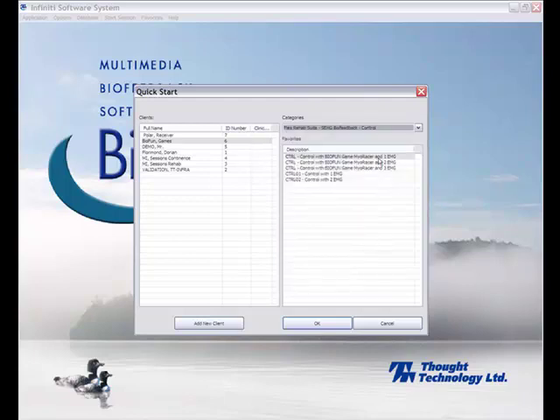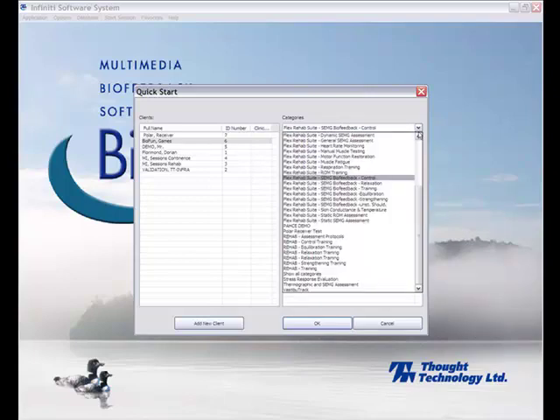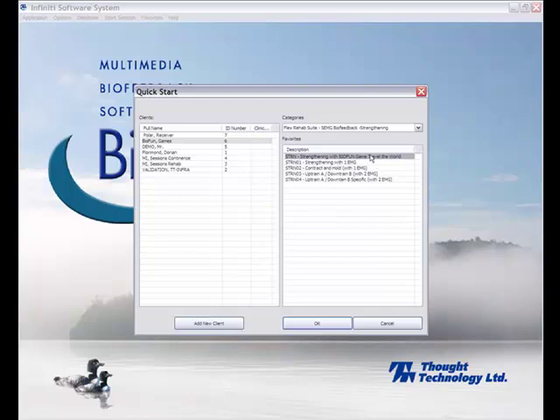As you can see, BioFun has installed three new files on top of my suite. Now I select Strengthening because that's really what I want to do. And I'm going to select Strengthening with BioFun Game Travel the World. I press OK.